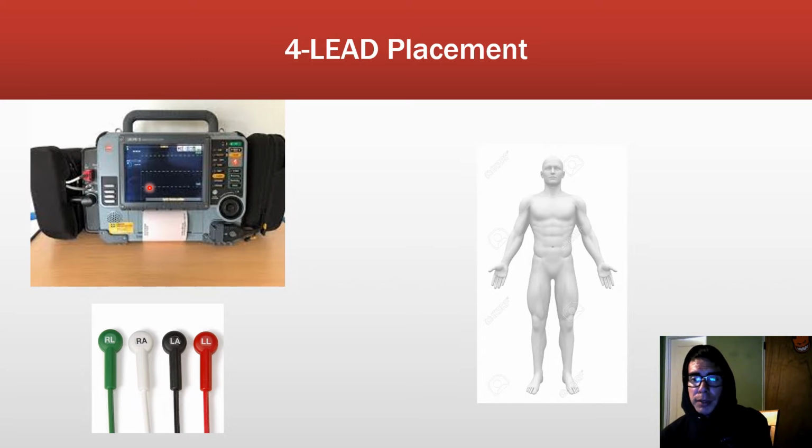So it's a measurement of cellular metabolism. It also displays a little waveform that's on this screen right here, and that will tell you how easily they're actually physically moving the air in and out. So for instance, it'll look like that, capnography waves, or it can look like that.